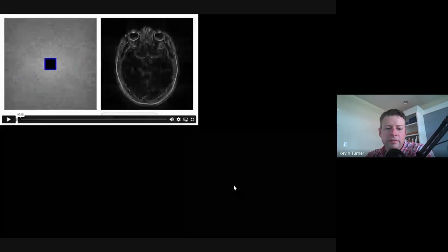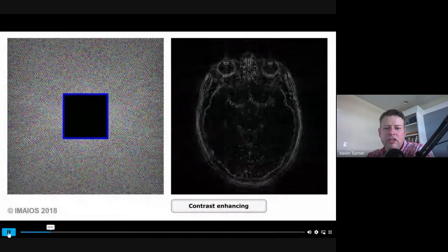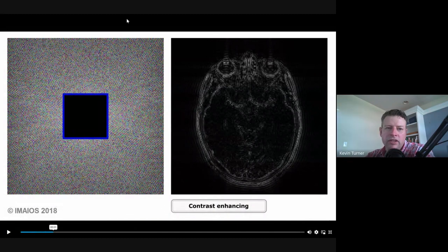Resolution then is the sharp lines in the image. So if we look at an image with just the resolution, all we can see is the outline of all the structures. Encoding is what gives us these sharp lines. You can almost think about it as a paint by numbers. Encoding is making the outline, and then the RF energy is determining what color you're painting all the different structures inside of it.